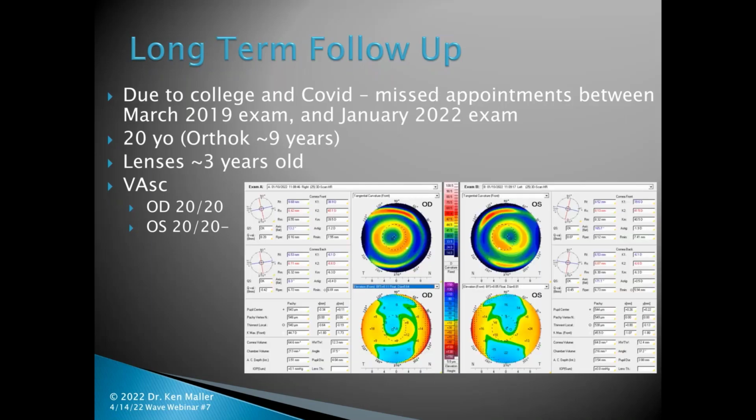These were the maps from that day. So despite the fact that the lenses were kind of beaten up, he's still doing exceptionally well all these years later.